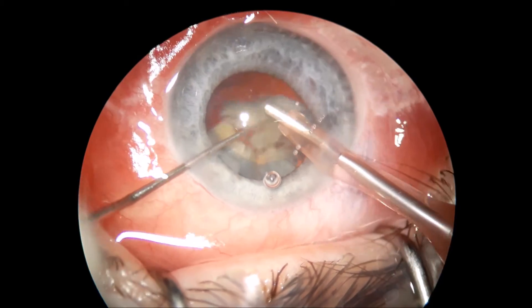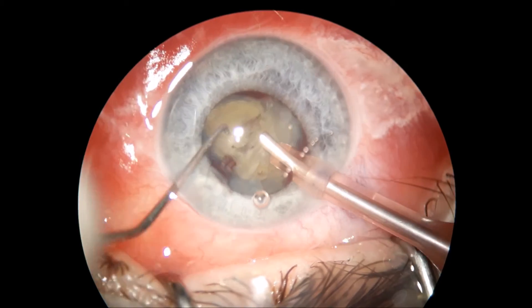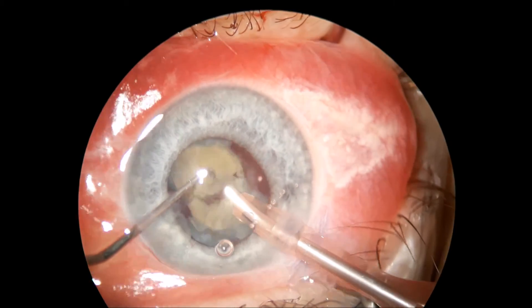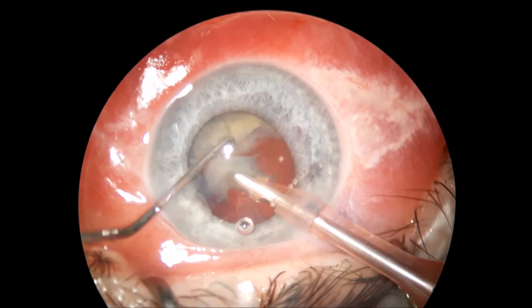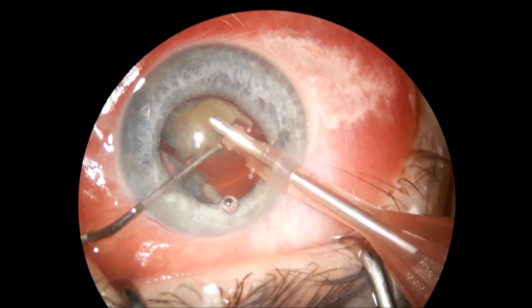I am going to stop here for a second and fill out the anterior chamber with some viscoelastic. I will also change the chopper and get a blunt one because this one is very sharp.